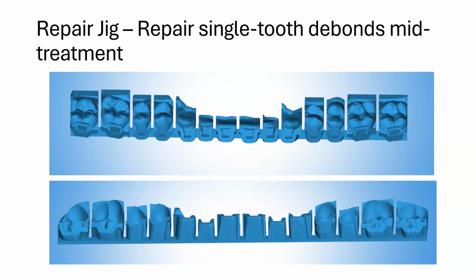Good. The software I feel is excellent. I have played around with all the other indirect bonding software available on the market. It is extremely powerful. Two-thirds of the features that it has, I never use. As I've got my flow down, it still takes me on average 12 to 15 minutes to set up a case the way that I want it. Sometimes I start going down little rabbit holes where I'm fine tuning my treatment plan. We do case share, so they're very specific treatment plans on what I want for a particular case. But I also truly feel that the time and energy I put in properly setting up a case is going to yield dividends down the road.